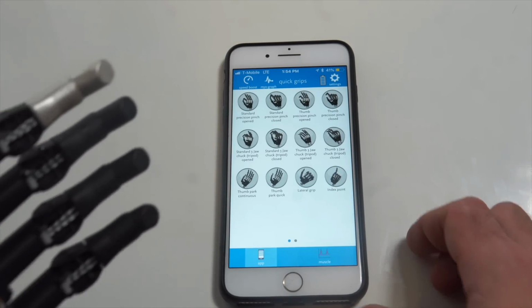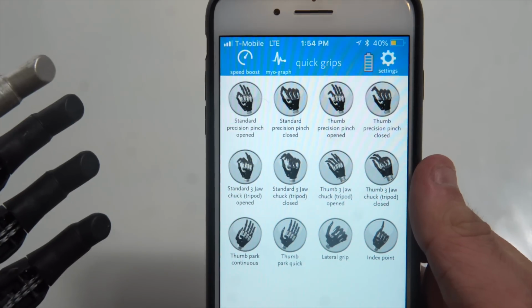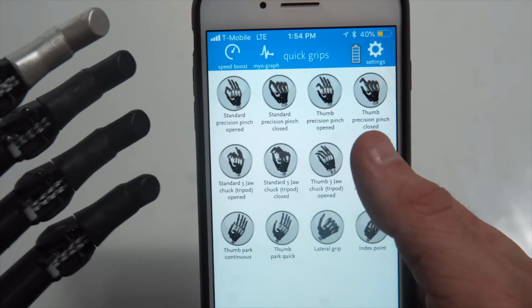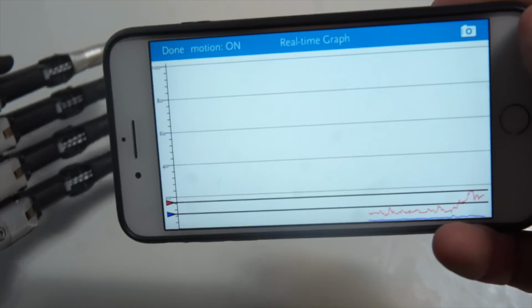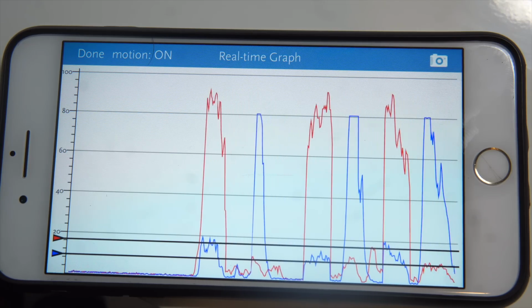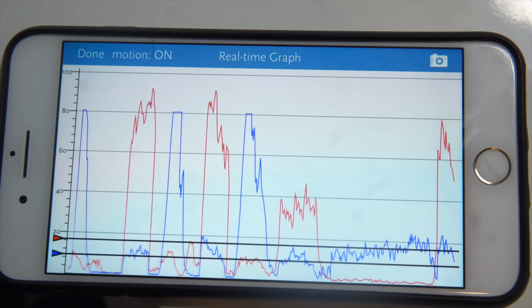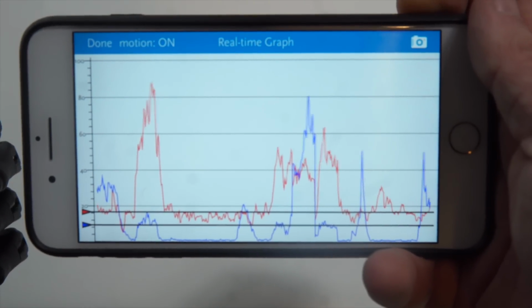So you see, logging into the Touch Bionic app, there's a bunch of different settings and different grips. See if you guys can see that. So we have all kinds of different positioning, different grips, and it'll actually change it on the hand as I do it. One really cool thing is it has this myoelectrical graph that, when I contract the hand, open and close, it measures the signals. The blue being the close contraction and the red being the open contraction. So it can tell me what muscle groups are firing effectively or ineffectively based on the way I'm controlling that. And I can change the different settings on that, which is really, really cool. It's pretty awesome to see.